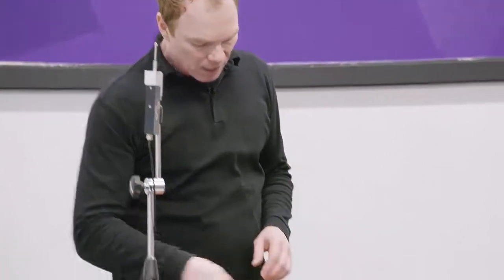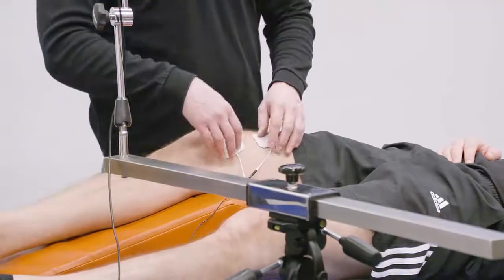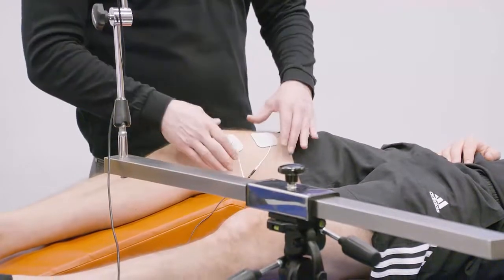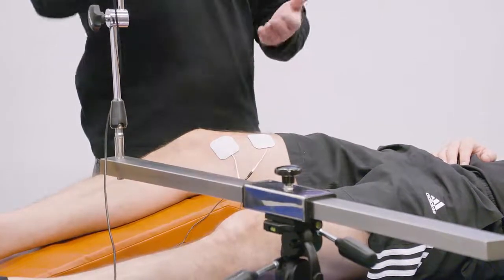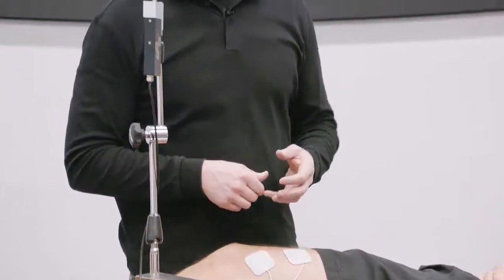Where exactly do you position the sensor? Each muscle has certain guidelines, but in this case it's straightforward — I will put it in the center of the muscle belly, perpendicular to the surface of the skin. When the muscle contracts, it will generate movement in that direction, so I position the sensor in the direction in which the muscle belly will deform. Guidelines are given every time a new person is taught how to use the TMG.